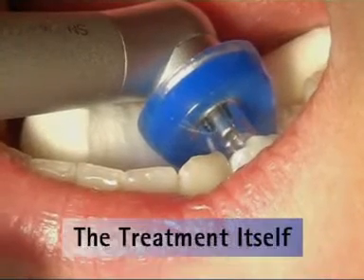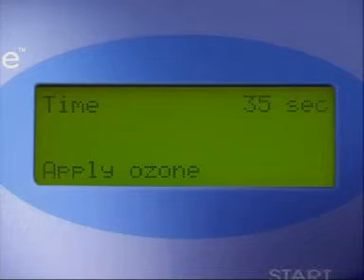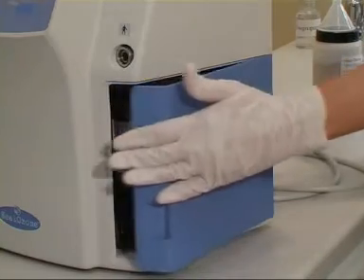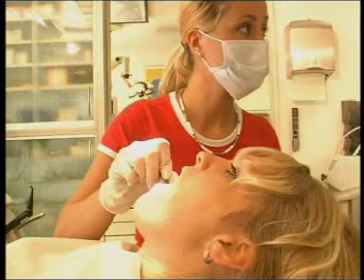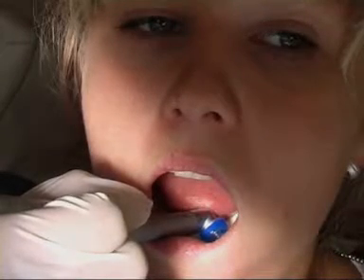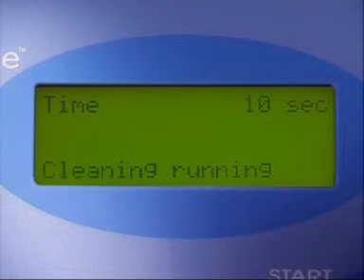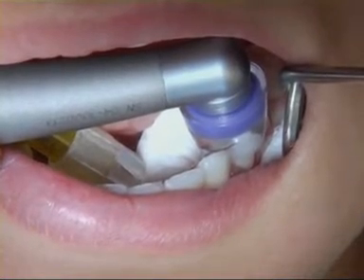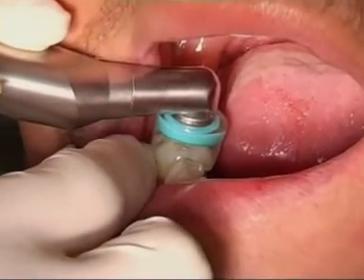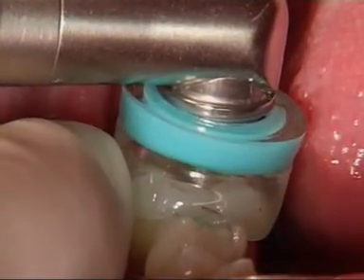Once the silicone cup is perfectly positioned, treatment can begin. Ozone is applied. The display shows the remaining time for the treatment. If the ambient air being taken in is too moist, the system automatically switches to dry mode in order to subsequently continue the application of ozone. The rinse procedure then occurs with the cup remaining in place on the tooth. During this rinse procedure, the only element incorporated in the circulation is air, and the remaining ozone is drawn out of the hose and converted back into oxygen.